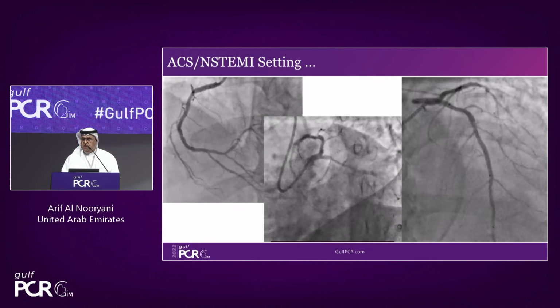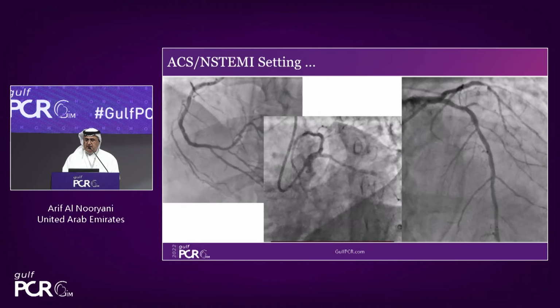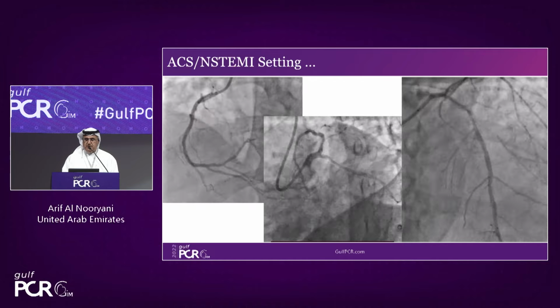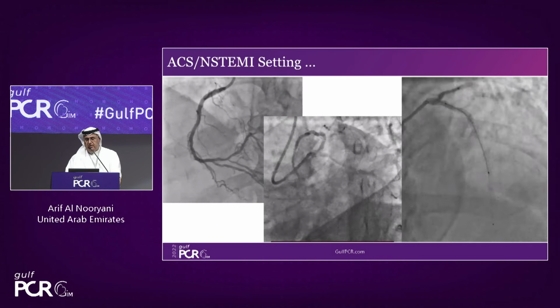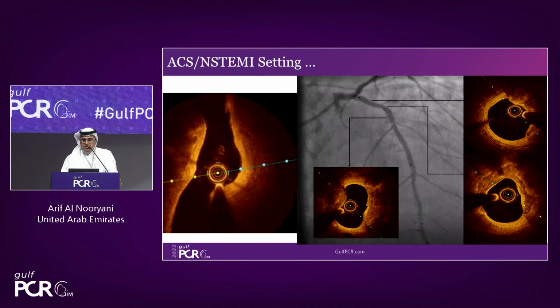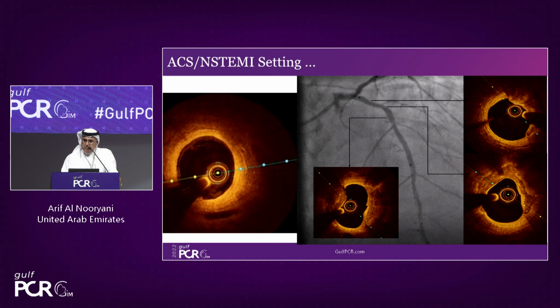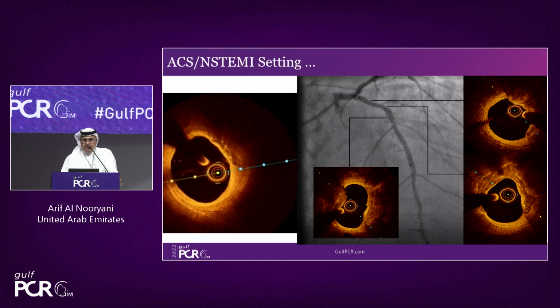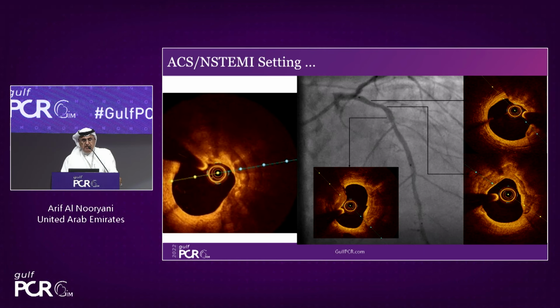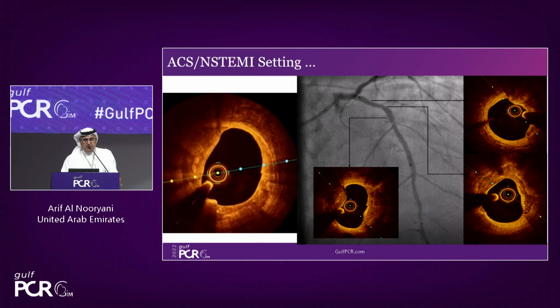Stent occlusion. So look at the LAD, that's the culprit where we have seen. There looks a little bit of haziness after the first septal, at the septal and diagonal, if you can appreciate that. So we needed to understand what this is, and here comes the role of imaging. We do an imaging, and we can see on the right side there is quite heavily thick calcium, media calcification with a thin cap. So this is a nodule also in the lower picture in the middle. You can see a very ugly nodule with almost no cap at 11 o'clock. This is the image. You can see it's more than 180 degrees, a very ugly case.